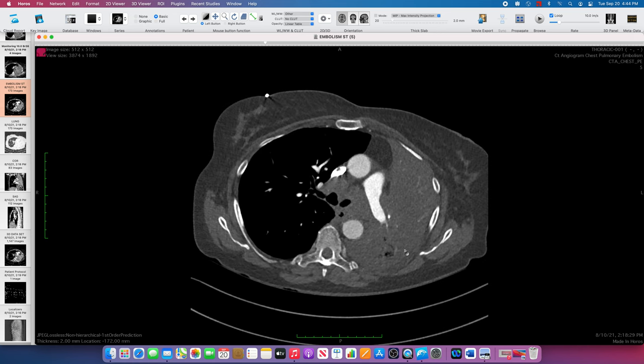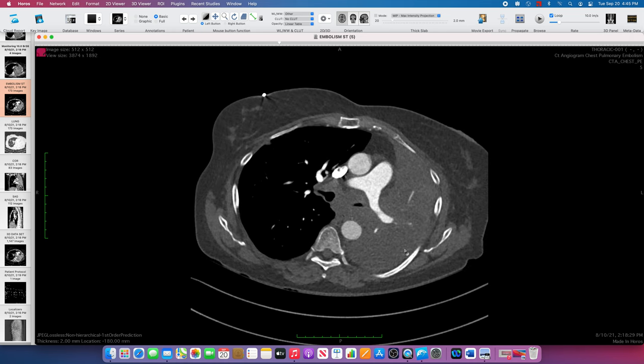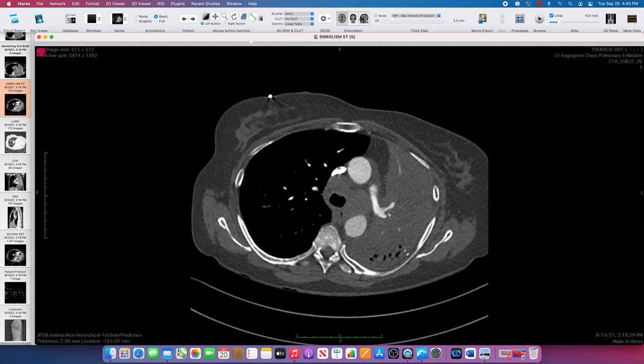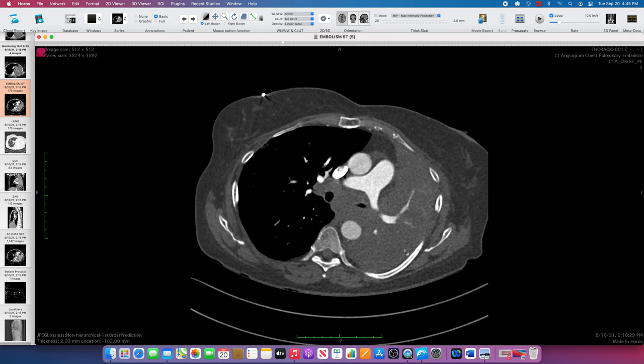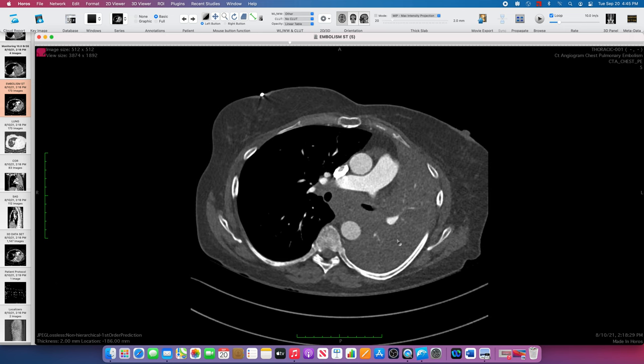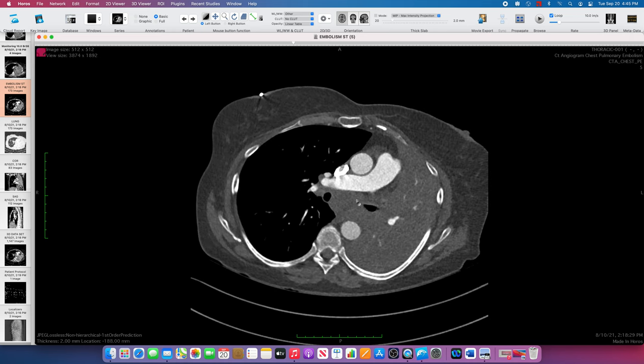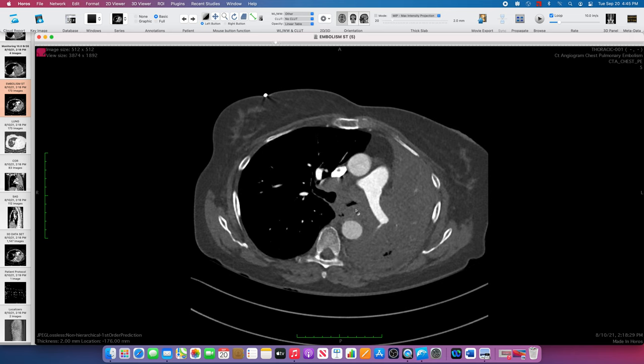If the pneumonia is lipid-laden, then it's something that's called golden pneumonia or endogenous lipoid pneumonia. But at the very least, we've got a central obstruction with a post-obstructive pneumonia, and then we look for adenopathy, and here we see a large subcarinal enlarged lymph node.